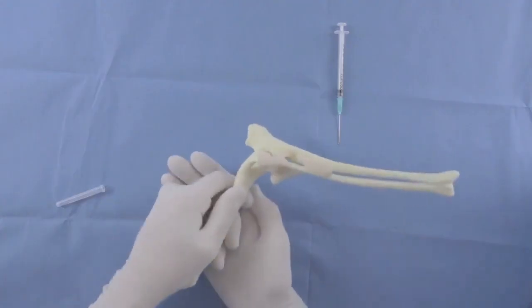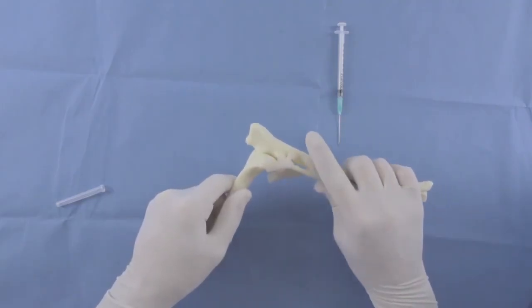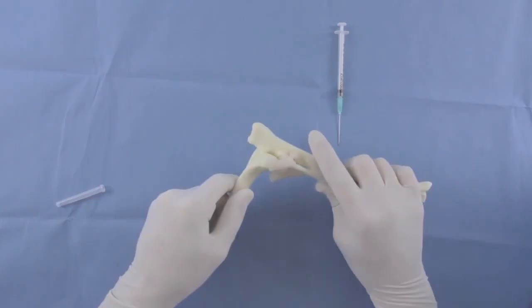To assist with the first two approaches, you can place a folded towel under the humerus. The weight of the distal limb will then help open the joint space.